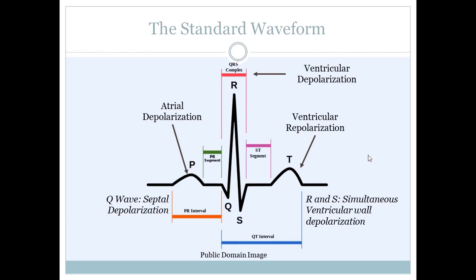Repolarization? What happened to the atrial repolarization? It happened, but it's buried in the QRS complex. Because the atria are much smaller than the ventricles, and the ventricular impulse is a lot more powerful, the atrial repolarization phase is buried within the QRS complex. It is not a distinct entity because it is overwhelmed by the signal from the ventricles.